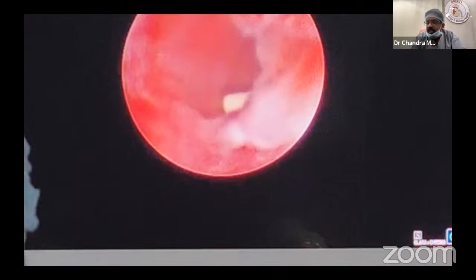You will be safe. You can see the ureteric catheter nicely, which was in the upper ureter. Then you are very comfortable. All the fragments you can observe easily in supine PCNL. Once it is completely clear, you will be very happy. It takes only 2 minutes more. If you use laser, blanching happens, and in 1 or 2 years there is a chance of stricture. If it is straightforward, bulk is seen, okay.